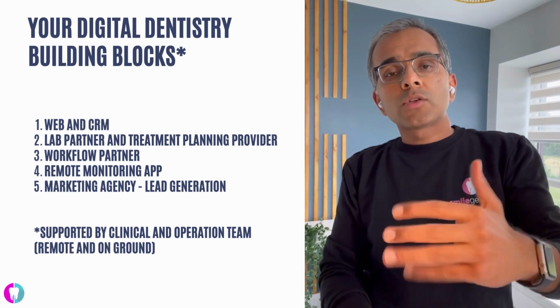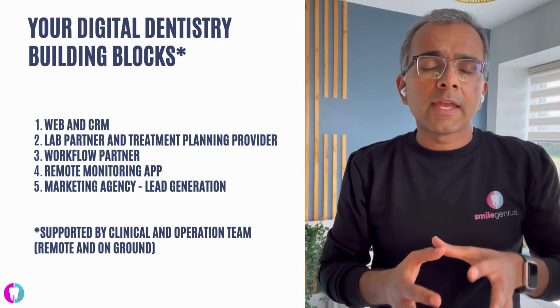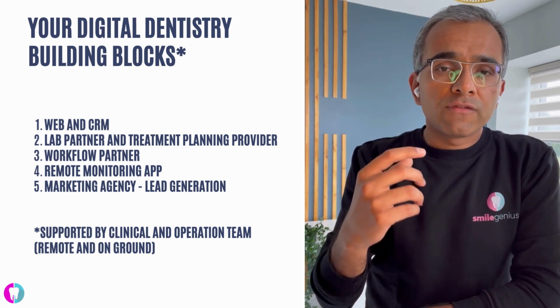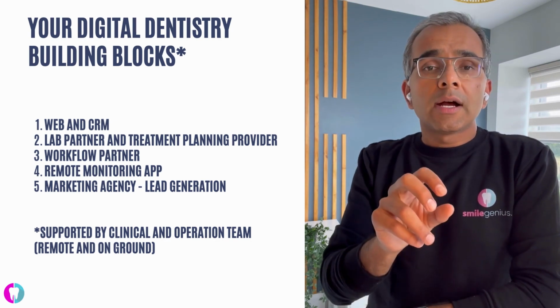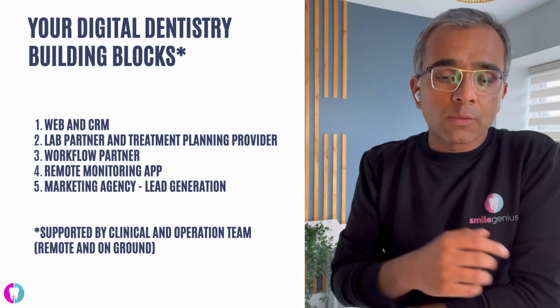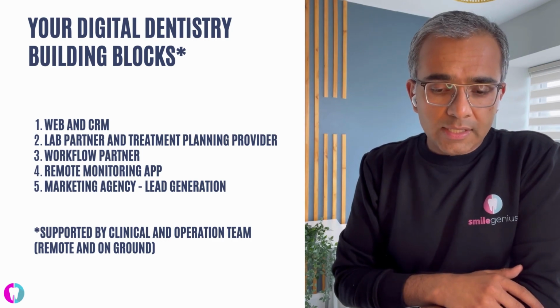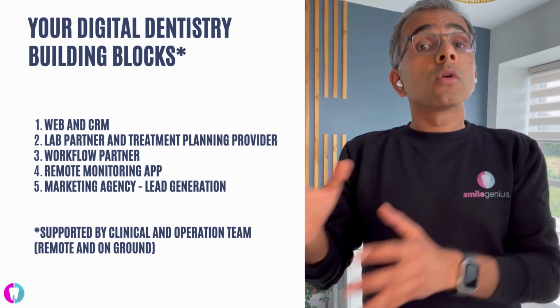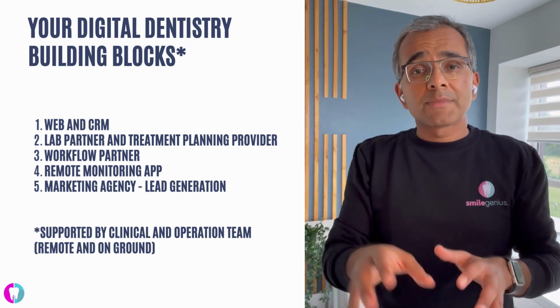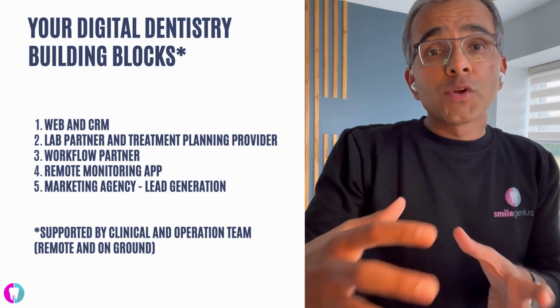And when you are in talks with your lab partner and identifying which treatment planning software they are using, you need to find out whether that suits you. Test a few treatment plans with them, send them some STL files, and understand whether they are the best ones for you, or look out for a new treatment planning provider as a partner.